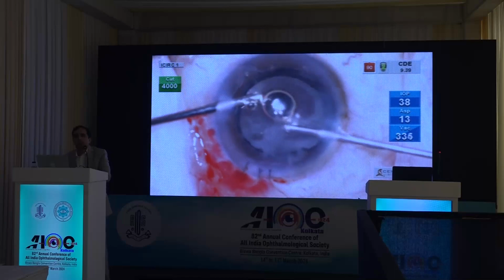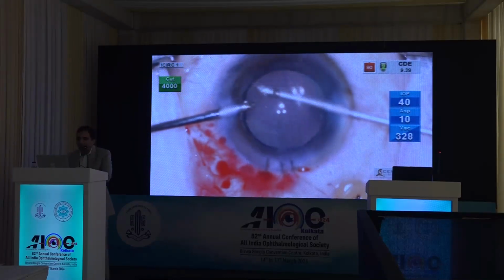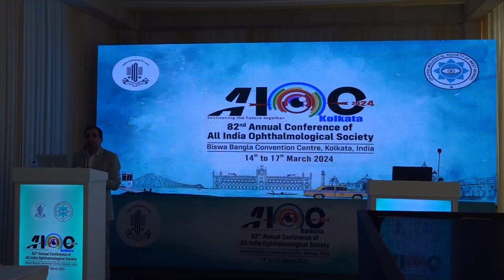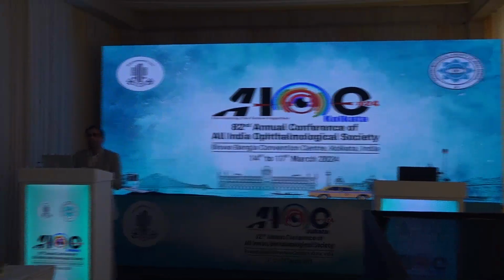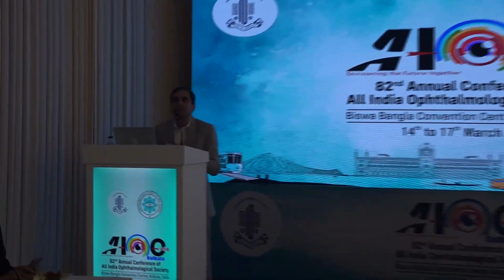So I'd like to end here, and the most important take-home message that I would like to share is, irrespective of whatever technique you are comfortable with, limbal or pars plana, one may have a slight advantage over the other. The take-home message should be, vitreous needs to be tackled. It needs to be tackled adequately from this route or that route before going on to the next step. And diluted triamcinolone acetonide is something that all of us should have as a backup in our ORs so that the assistants don't have to scramble to find it. Thank you once again for the patient listening.